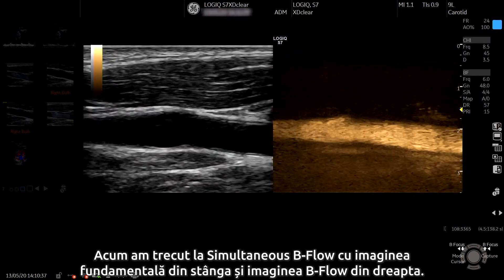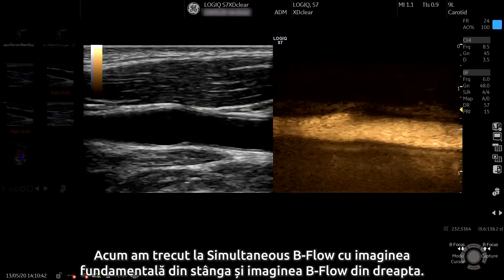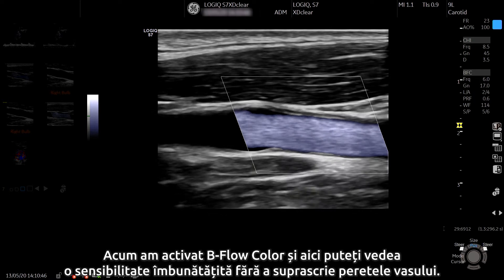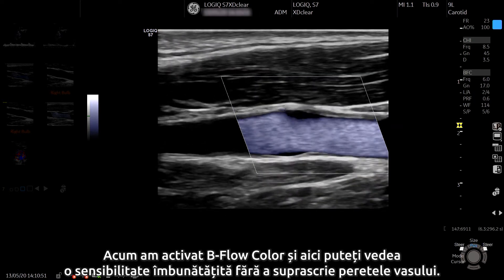Now we have moved to B-flow simultaneously with the fundamental image on the left and the B-flow image on the right. We've now activated B-flow colour, and here you can see improved sensitivity with no overwriting of the vessel wall.